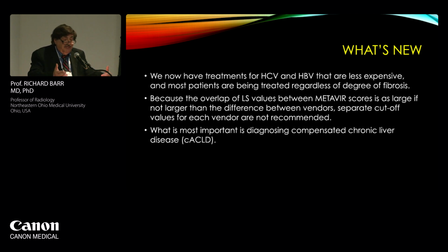Their fibrosis hasn't changed. It's all resolution of the inflammation probably. So we can do that. So we recommend that you now say, okay, their new value is 6 kPa. That's their baseline, and we're just going to follow that value. So the change over time is sometimes more important than actually looking at the cutoff values.